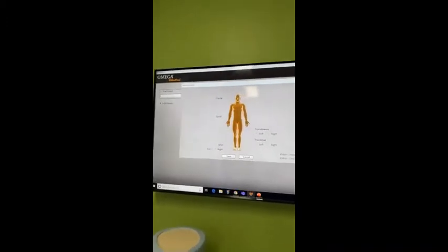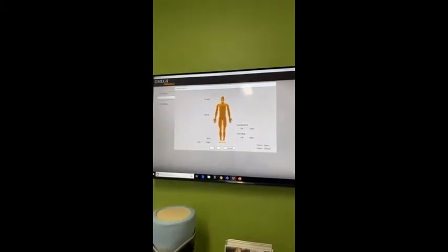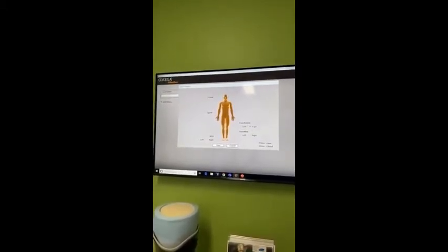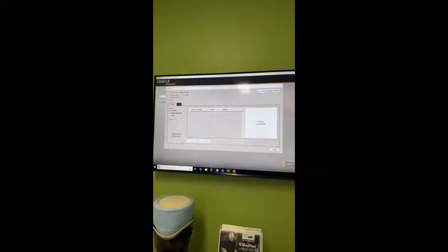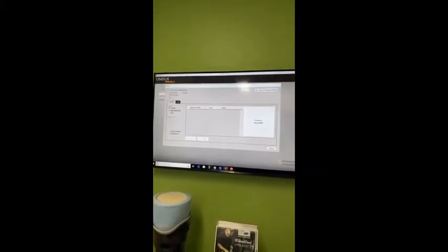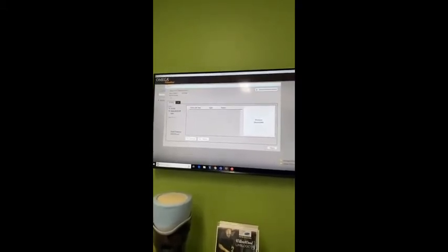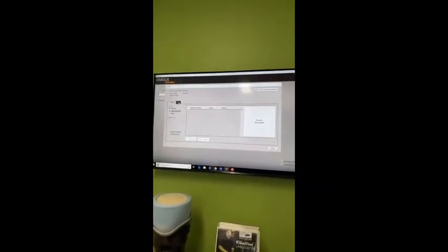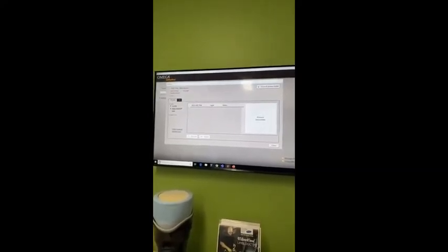Then we press create, and then we bring in whether it's a left or right, transfemoral or transtibial. So we'll start with a knee disarticulation patient for this. Then we press save, and that brings us into this patient information folder, which you can store multiple shapes of the patient. So if they're a bilateral amputee, if they were an AFO on one side and they're an amputee on the other side, you can bring in different modules into their patient card.